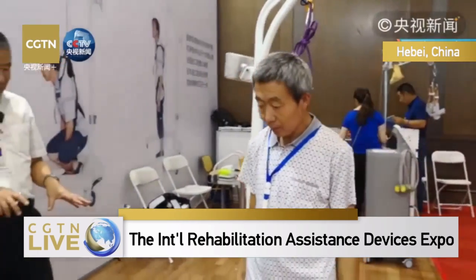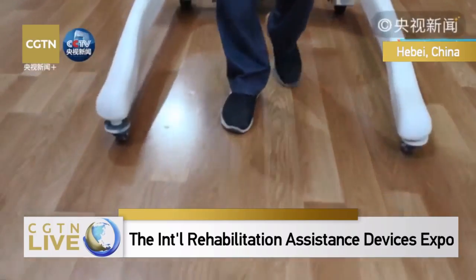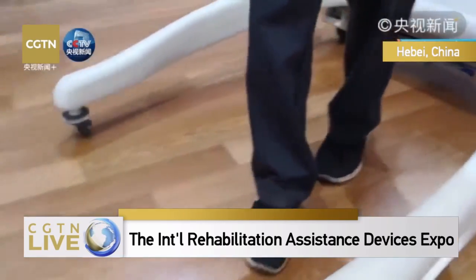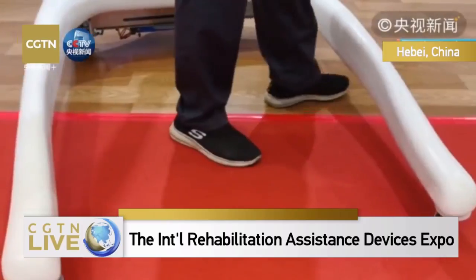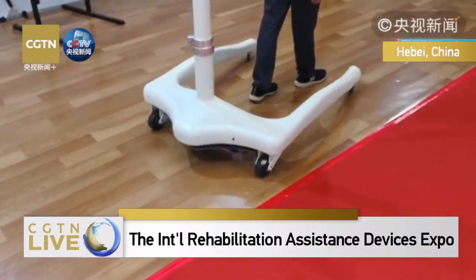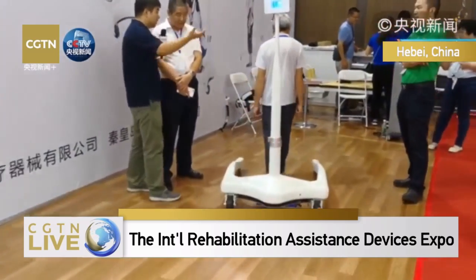This is an automatic walking device. It is state-of-the-art technology of distant vision. It uses similar technologies to driverless cars, that is the laser radar technologies, to capture the motion of the legs and feet of someone turning right, turning left, and this cart will be following the user simultaneously.